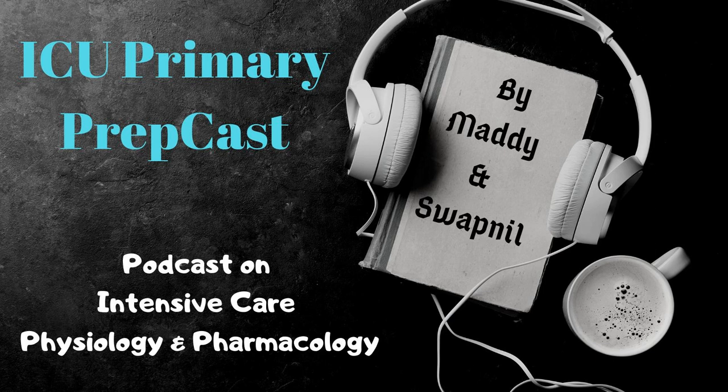The pressure bag is the next component, which is usually a 500 ml bag of normal saline, which is pressurized to 300 millimeters of mercury and attached to the tubing via a flush system. Fluid is slowly infused at around 3 mL an hour, and a flush system allows for a high pressure flush of the fluid to maintain patency and to check the fidelity of the system.